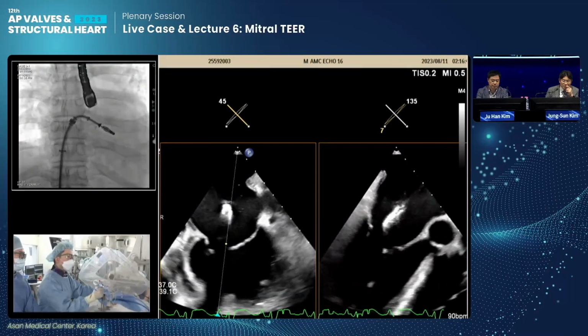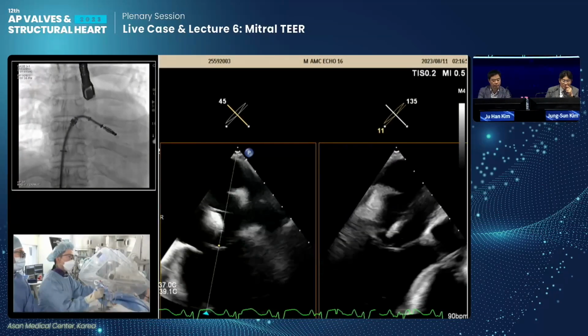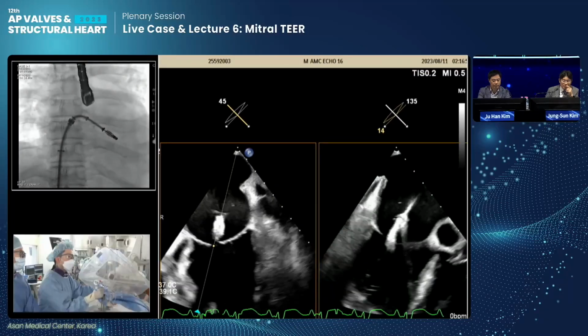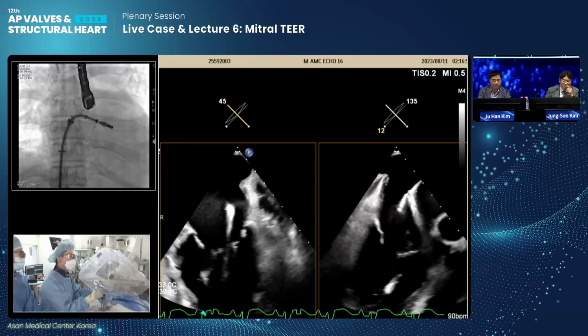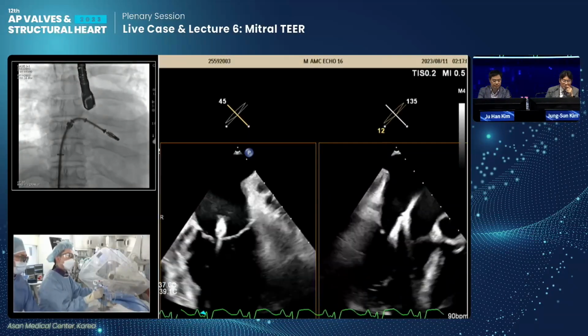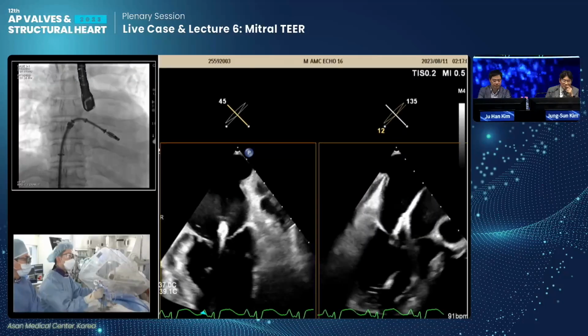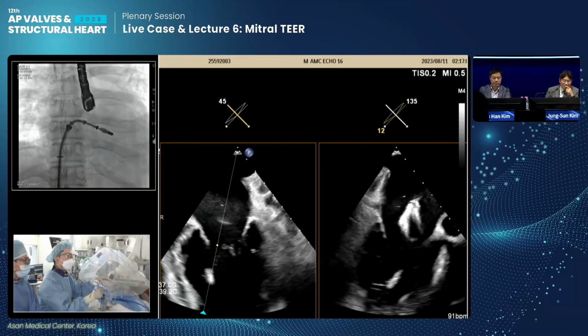Dr. Kim, how do you like this trajectory? Yeah, the trajectory is okay. Isn't it too medial dive? Do you like it? Yeah, looks like a little bit of a medial dive. Yeah, slightly. So I will release the M. And how about this? Oh, looks good. Yeah, looks better. And I will move a little bit to medial. Here is the target.